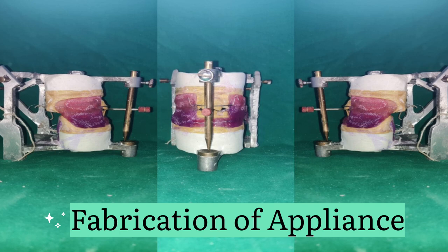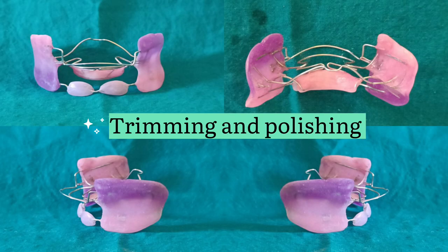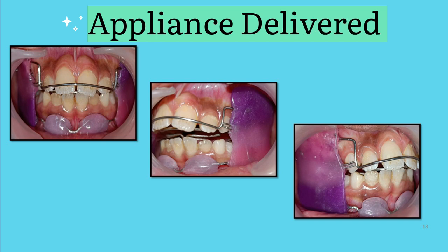After discussing each wire component, the next step is fabrication of the appliance. It is the acrylic component which makes the functional regulator a monoblock appliance. After fabrication, trimming and polishing of the appliance is done in order to prevent irritation of the soft tissues.